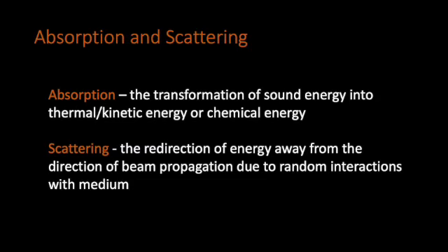Absorption and scattering are the two main ways by which ultrasound beam energy is transformed in the human body, and this results in the attenuation we've seen. Absorption refers to the way that sound energy can be converted into another form of energy, and most often this is heat energy. Every now and then a little bit of chemical energy as well. But mainly when we think about putting an ultrasound probe on a patient, we have to be aware that the theoretical risk of heating up that tissue is very real.